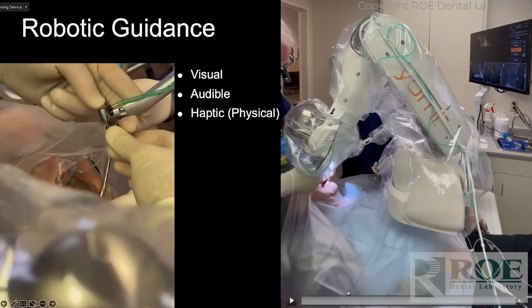Those beeps told me I was in the right position. When I got to depth: beep, beep, beep — a triple beep. That's really important because when you're doing these surgeries there's a lot going on, and so the audio cues are a really big deal.